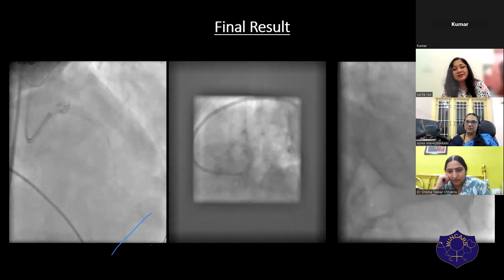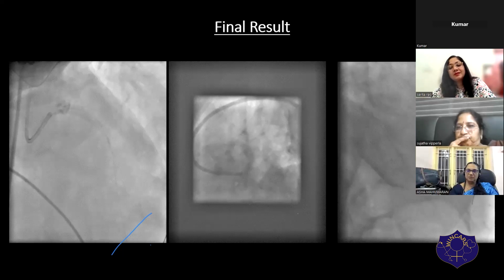And what Ziad Ali was telling at this imaging conference was that if you have a very calcific lesion, and your expansion is reasonable, anything above 80%, you've gone up to appropriate NC balloon up to 22 atmospheres, stop there. Don't overdo it. That can result in greater problems. I totally agree. I think we should accept. She's got 90% expansion, 89%, and TIMI 3 flow. It's looking good angiographically, good lumen area. I think we should leave and stop there, not go on trying for perfection and result in a perforation.